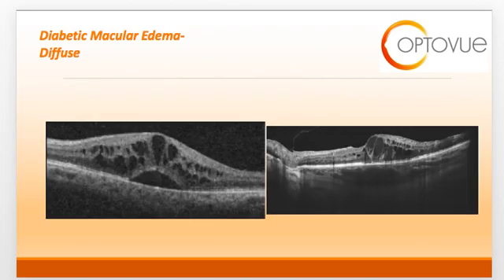Diffuse macular edema is characterized by more widespread vascular abnormalities with larger areas of thickening. Not as many hard exudates, but many more cystic changes within the retina, as you can see on both of these scans. On the left-hand side, you can see that there is also a subretinal or neurosensory detachment indicating the chronicity of the disease and the effect that it's having on the entire retina. On the right-hand side, you can see the diffuse involvement of the cystoid macular edema, again involving the fovea. Thus, this would be an urgent referral.